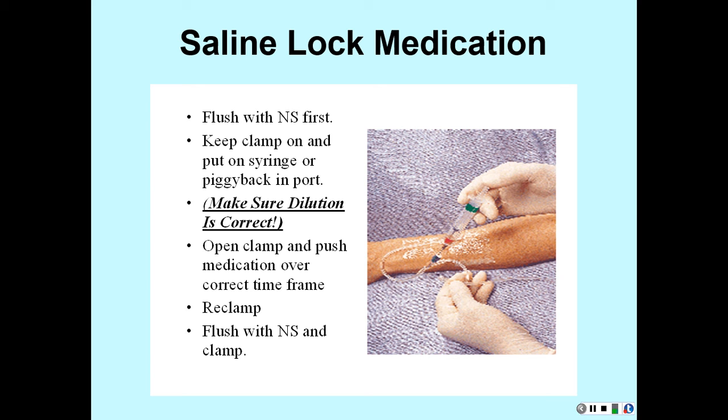One technique I want you to notice is, now this patient has an extension tubing, or I really think this is an IV tubing here. They've got a port, but you see right here what they're doing. They've clamped or crimped the tubing here. That's so that when they push the medicine in, it goes to the patient. It doesn't go backwards into this tube.